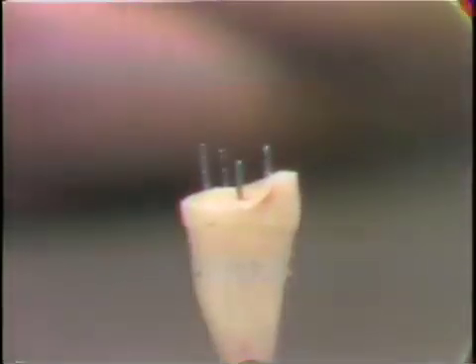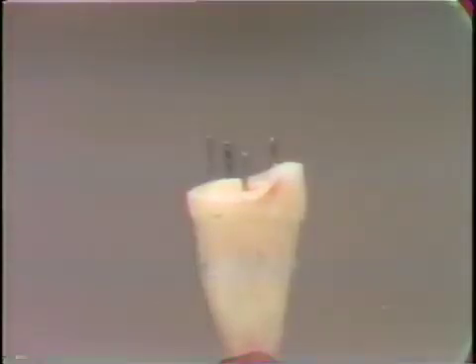holes. Now, in recent years, with the development of the composite resins, which have very high compressive strength, use has been made of those in building up the core. Such a core would be built up in exactly the same manner as for amalgam, although it's not necessary, of course, to leave the matrix on for so long a period of time. And once the composite resin is set, the preparation can be completed perhaps in one visit.